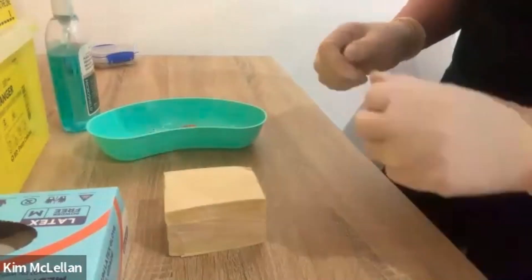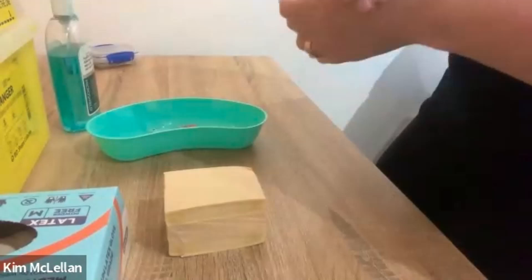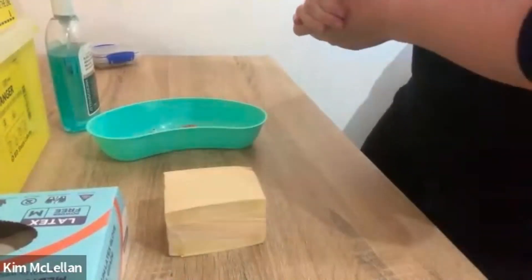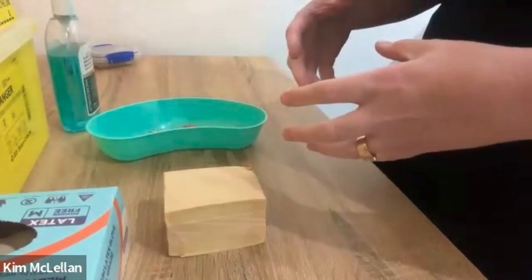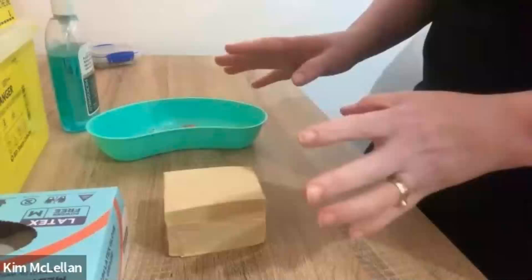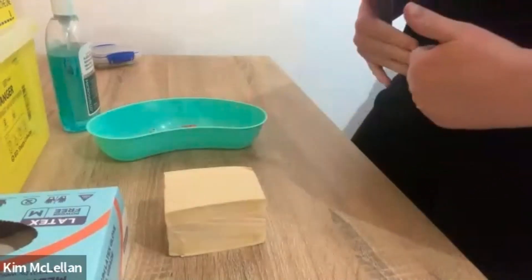So we need to go back to our patient. Hello Mrs. Jones, my name is Kim. I am the nurse doing your subcut injection. I'd just like to confirm your name and your date of birth, and your NHI number — I'll just check your ID bracelet. That matches perfectly with my drug chart. I'm going to be administering a subcut injection of your insulin into your tummy. Do you remember which side you had your injection done last? You had it on your right side, so I'm going to do it on your left today. There doesn't seem to be any bruising, abrasions, or any concern I need to avoid. I need to make sure I complete your subcut injection at least five centimeters away from your umbilicus, your belly button.